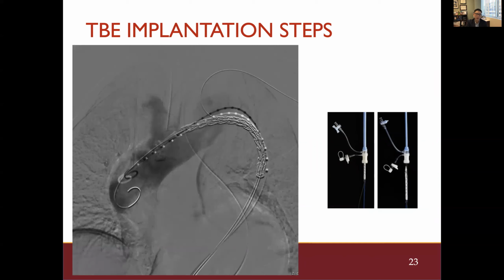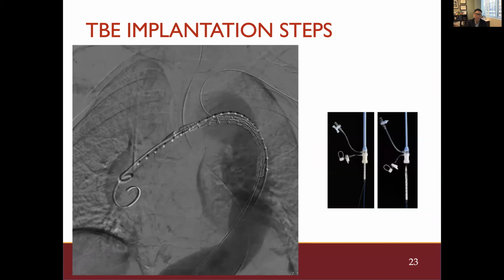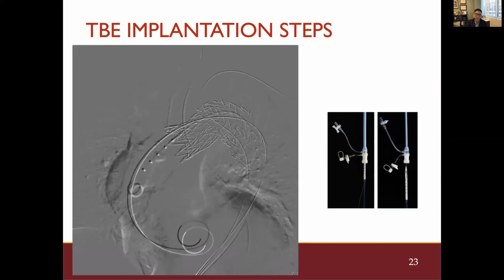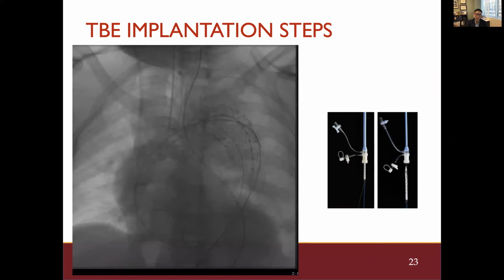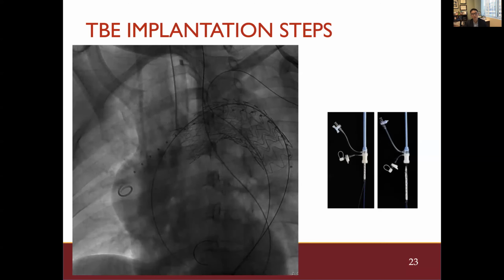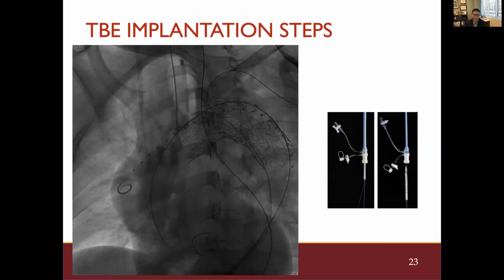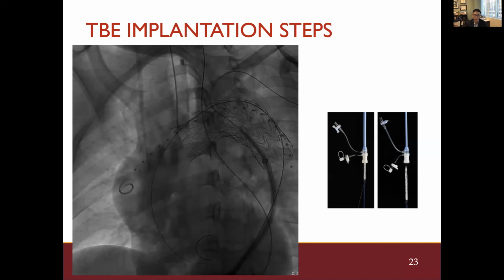Typically, we establish left brachial to femoral through and through wire access, which can be fed through the preloaded wire system across the inner branch. The aortic piece is deployed first, then over this through and through wire, a branch component is introduced from the femoral approach. And as you can see here, sheath is advanced here, and it is crucial to modulate the tension here as the branch portal makes a fairly sharp right angle.